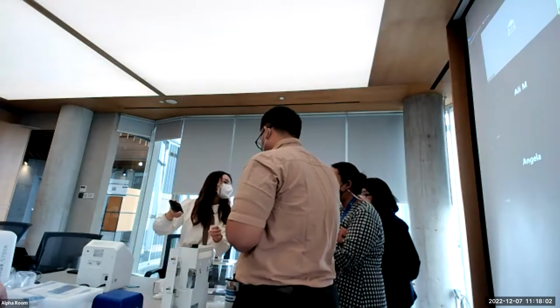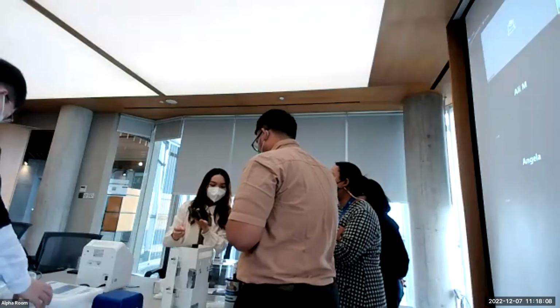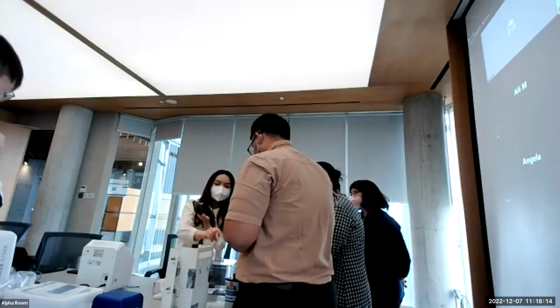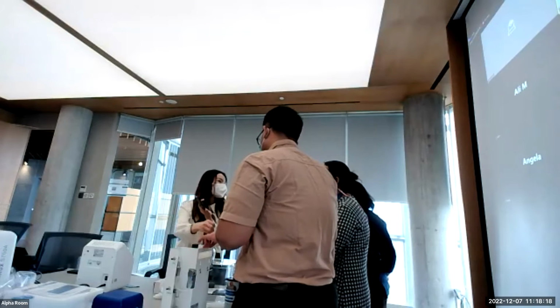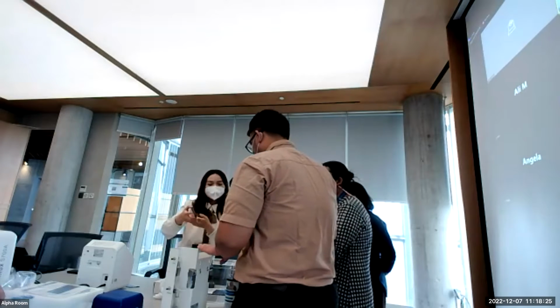So after you use it and turn off, it still stays connected to the anesthesia machine, and that's okay. Because if it is connected with the anesthesia machine but not connected with an animal, it won't get carbon dioxide. Okay, so it will not be used up.